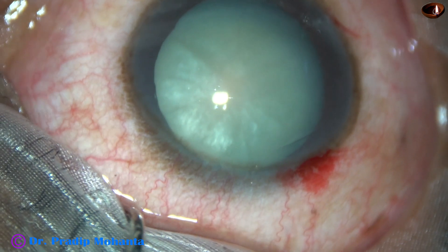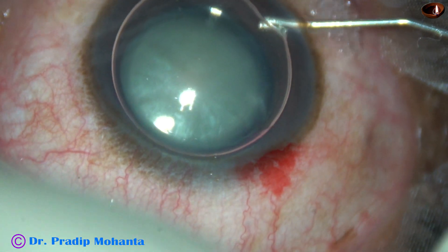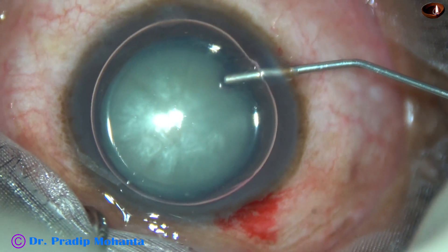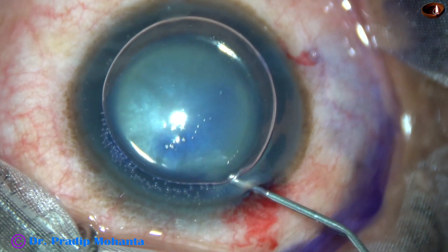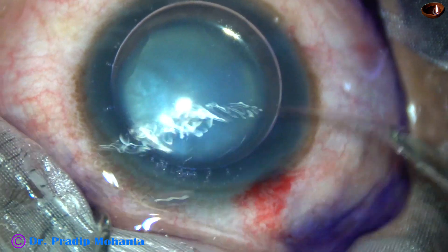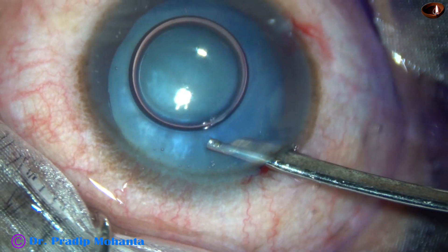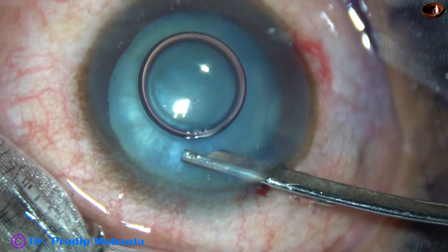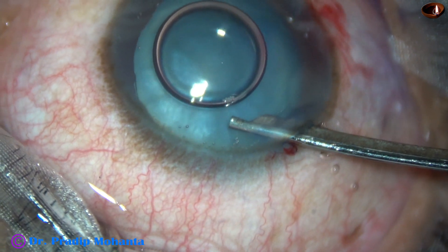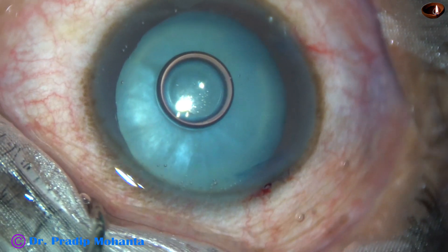The anterior chamber is filled up with an air bubble. Beneath this air bubble, trypan blue dye is applied over the anterior capsule of this white cataract. When we apply the dye underneath an air bubble, the concentrated dye sticks to the anterior capsule very firmly and very quickly. The dye is not diluted by aqueous and cannot stain the corneal endothelium, because the dye is over the anterior capsule and it doesn't come up.